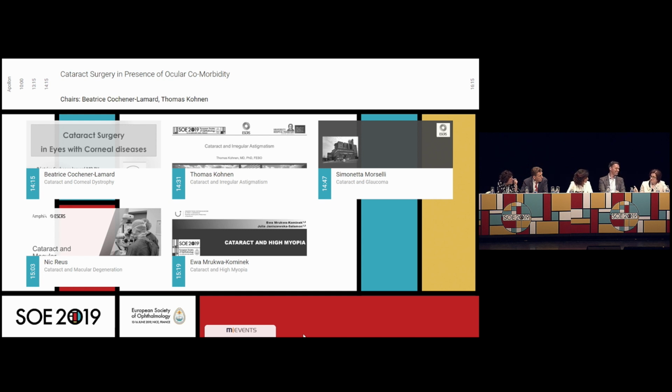Yeah, but our neuro-ophthalmological division made a study about these yellow lenses, and they noticed that 4% of the patients who have a white lens have some problems with the blue and violet colors, and these are the patients who have a higher concentration of the cones responsible for this wavelength of light. So for these patients, add-on lenses should be very good. We have no yellow add-on lenses on the market now, but in the future it could be an option for these patients. Yes, there are people who are very sensitive to the blue light.